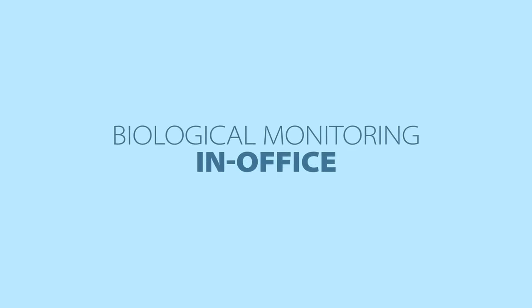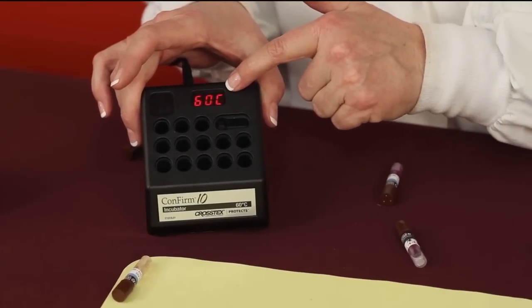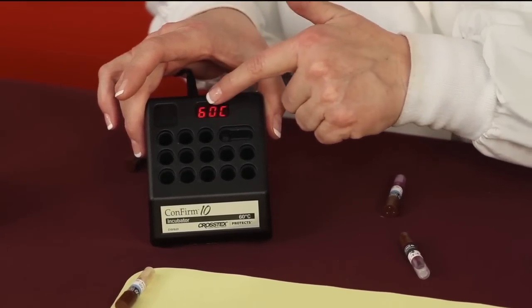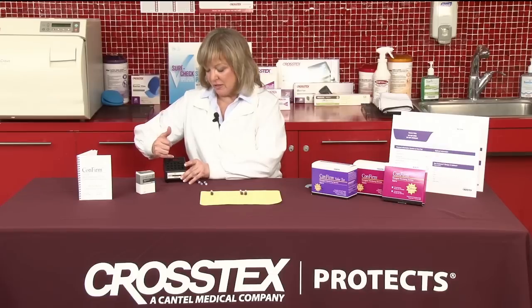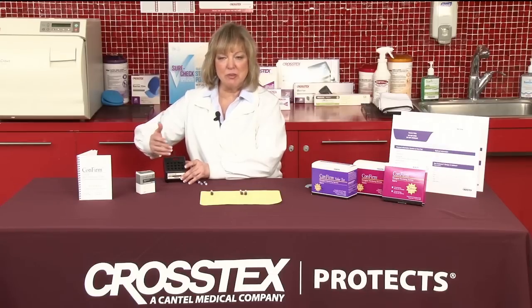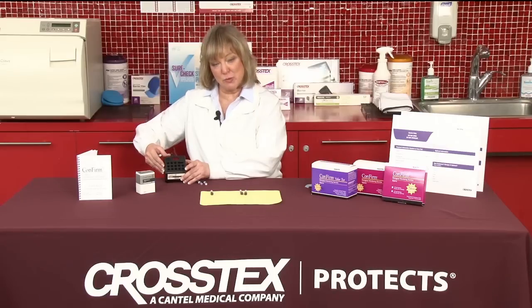Let's talk about the option of in-office first. When we plug in the black incubator, you'll see that an LED display appears. When it's first plugged in, this light is going to be flashing. When the light stops flashing, you will see a number of 60 degrees plus or minus 2, which means that the incubator has reached temperature.